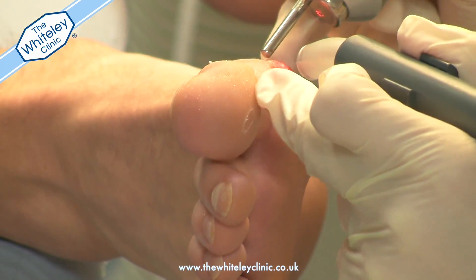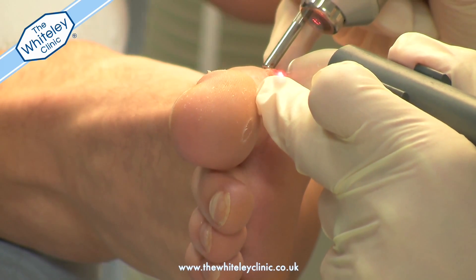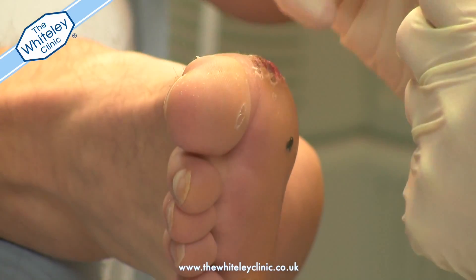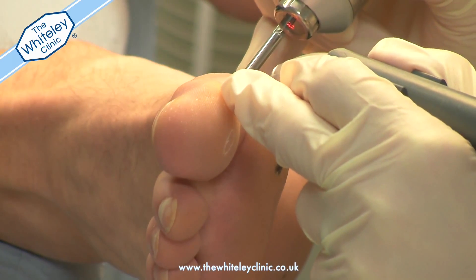The cryo machine is used to keep the skin cool whilst the laser is being applied. The area to be treated is covered by the laser beam two or three times.